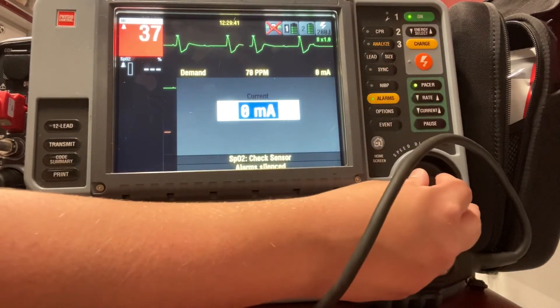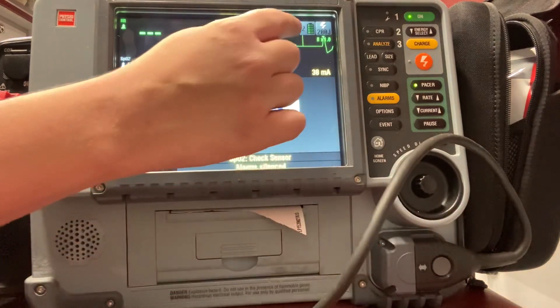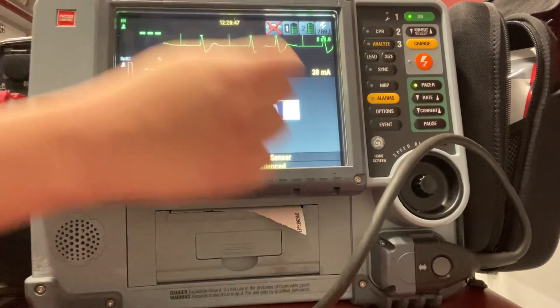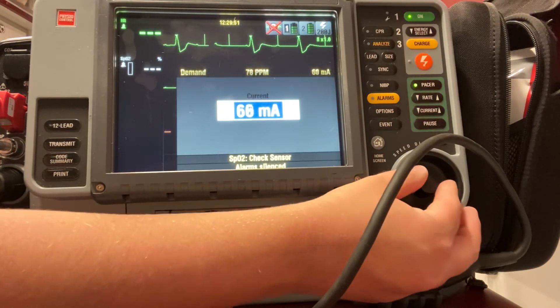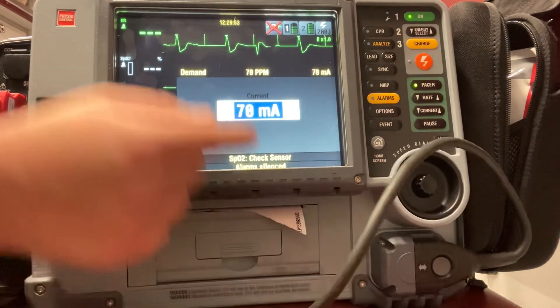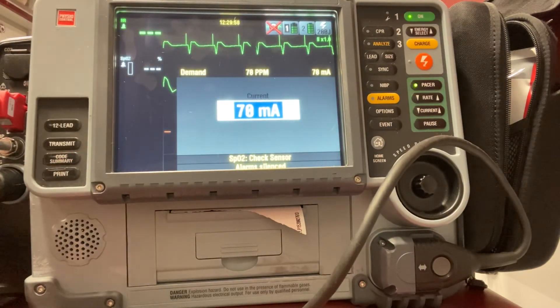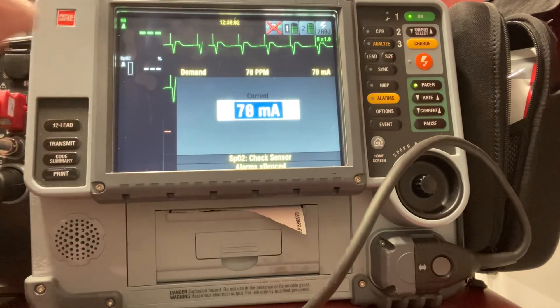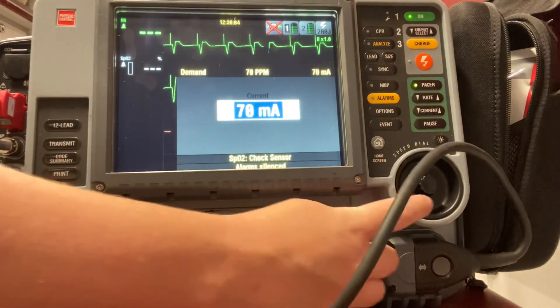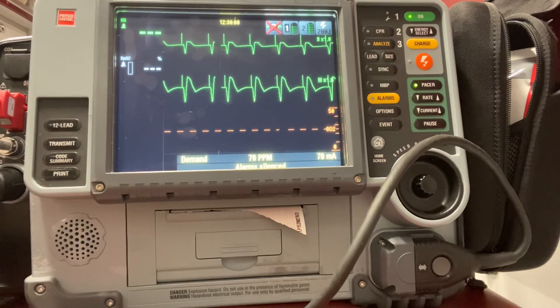It automatically brings me down to current. I'm just going to slowly increase the current until I see that spike match up with my QRS complexes. Now I can see my pacer is matching up with my QRS. The QRS is already wide in this rhythm, but I want to see that wide QRS come immediately following that pacer spike — that means I have capture. I can go ahead and press the center dial in again and now my patient is being paced.